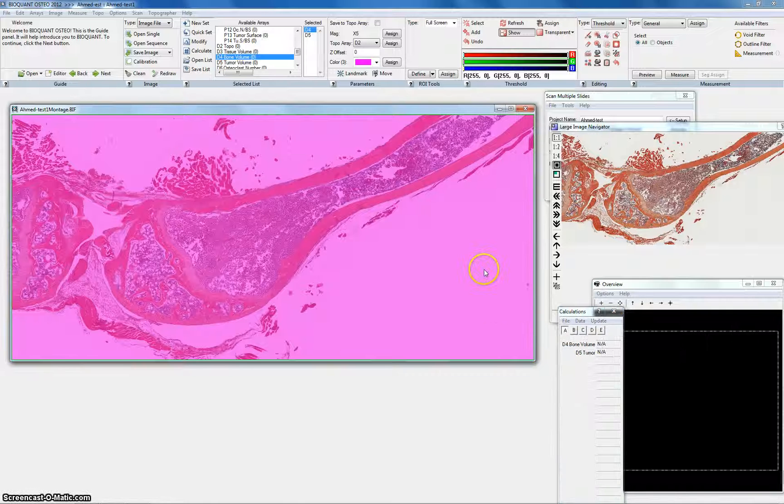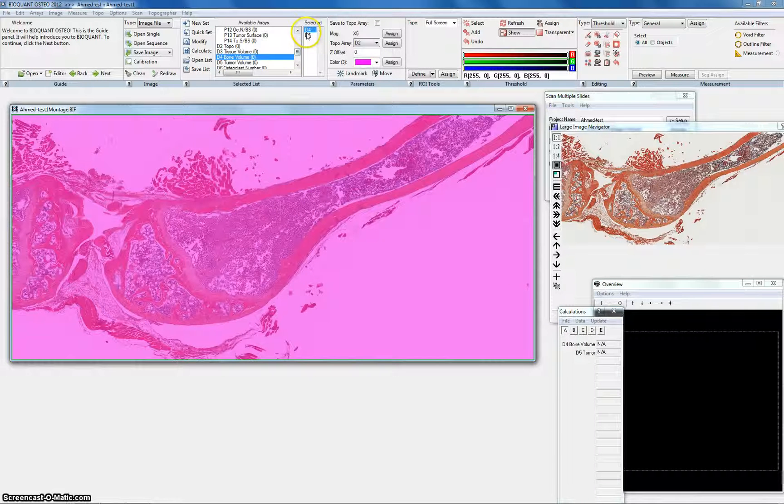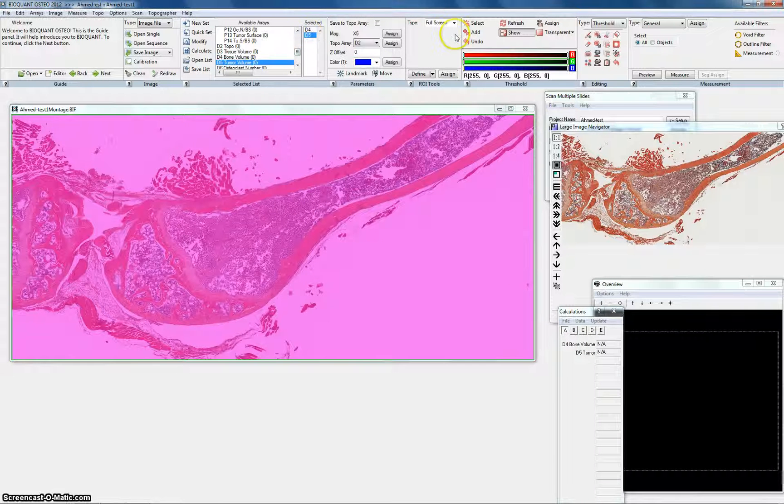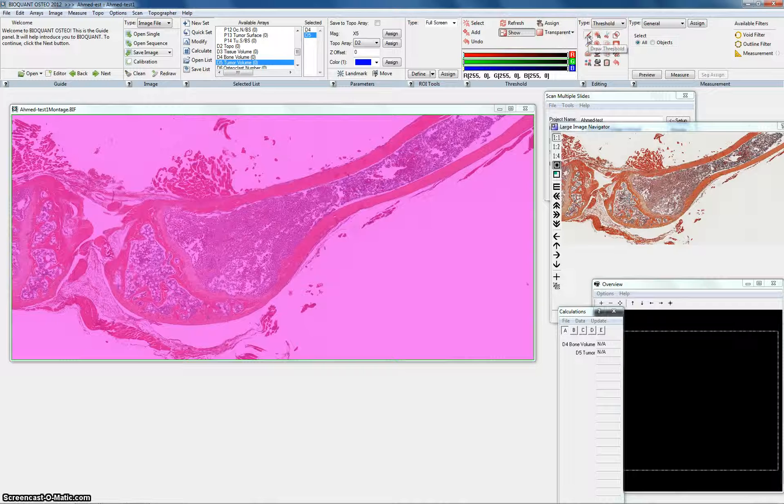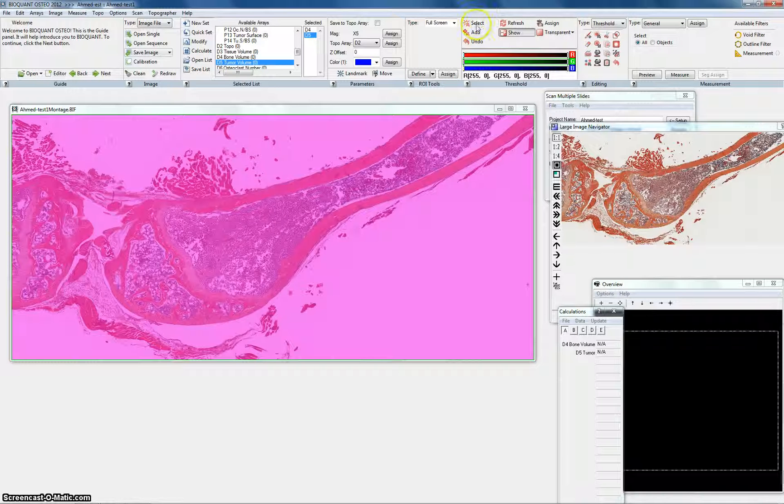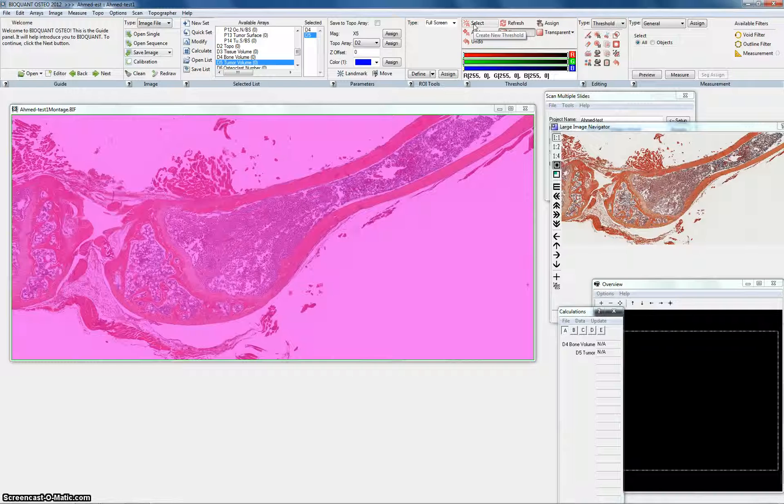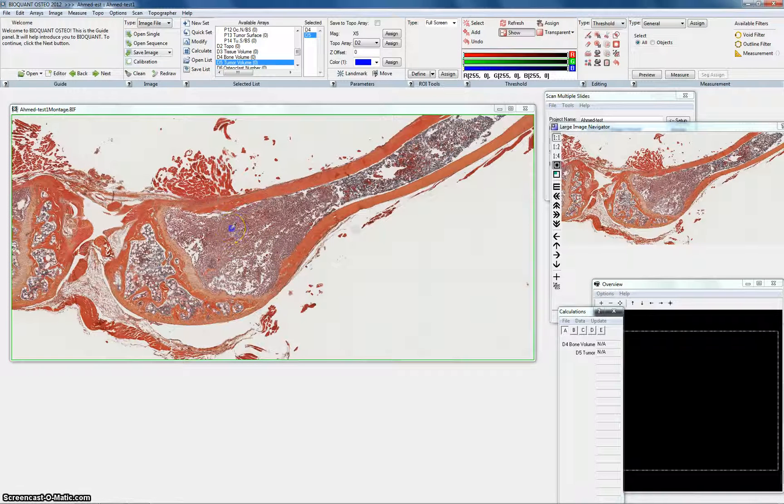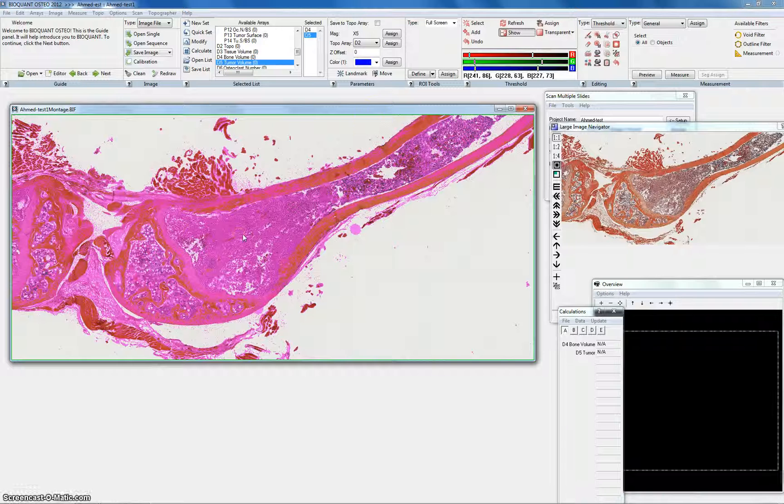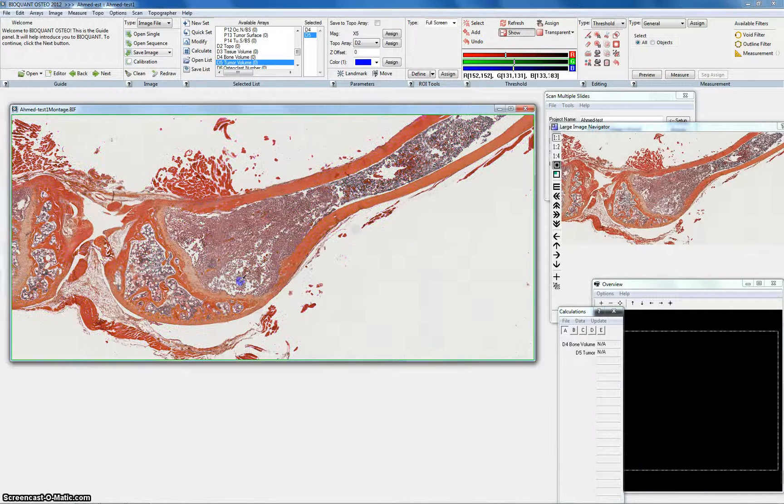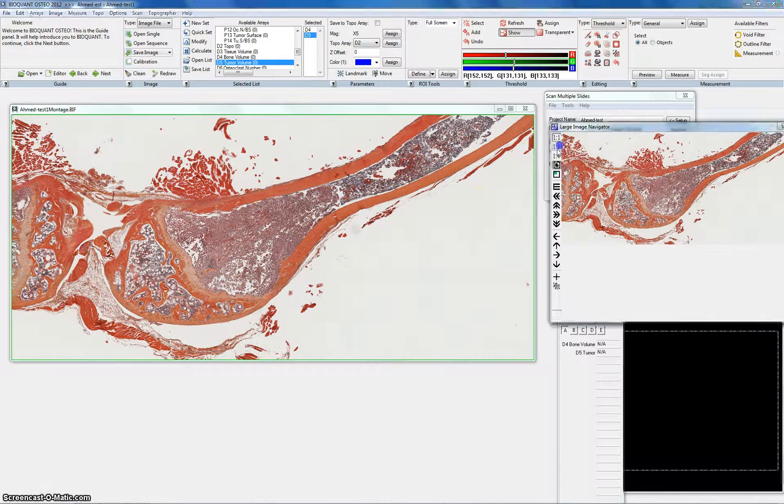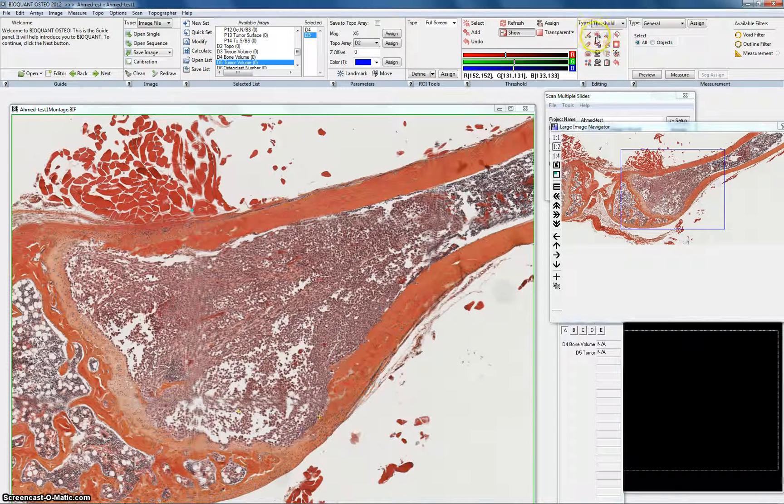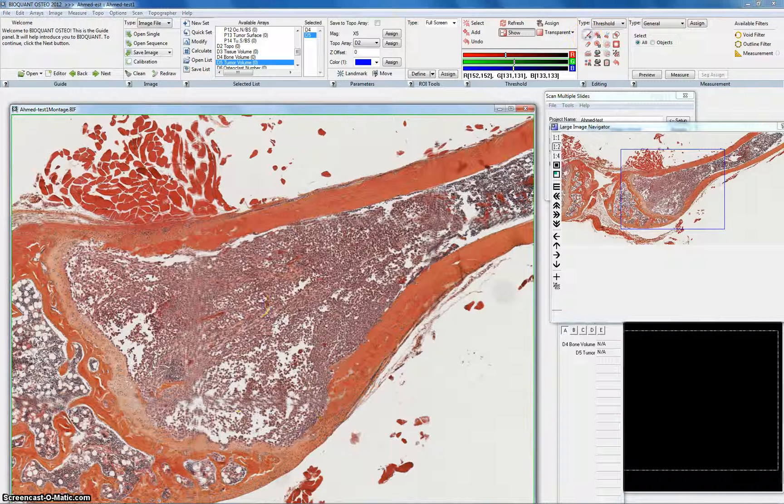Now we will start with the tumor volume. One thing I want to get you familiar with the tools here. I will use them one by one. Once you hit select it will give you a thresholding tool. Usually it doesn't work as good with the tumor because there is no definitive color for the tumor cells. So usually I would trace it by myself. It's easier. So this is the pen or tracer. This is the eraser and I'll show you how I do that.